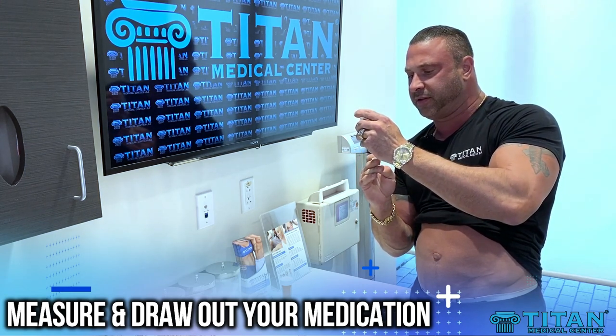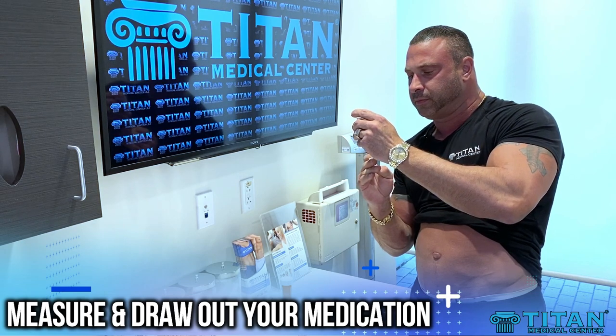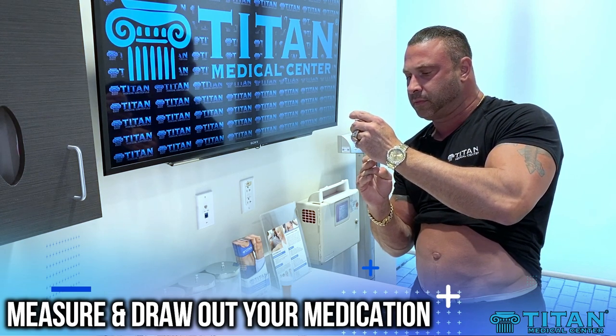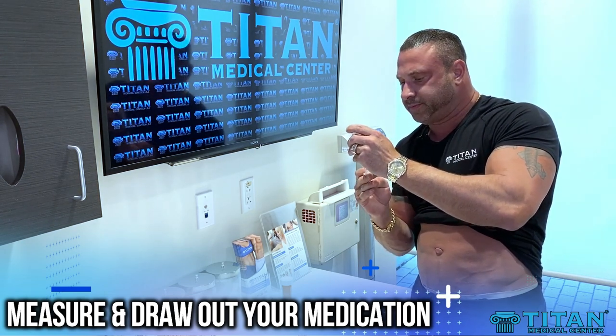So we have this here and we're ready to inject.